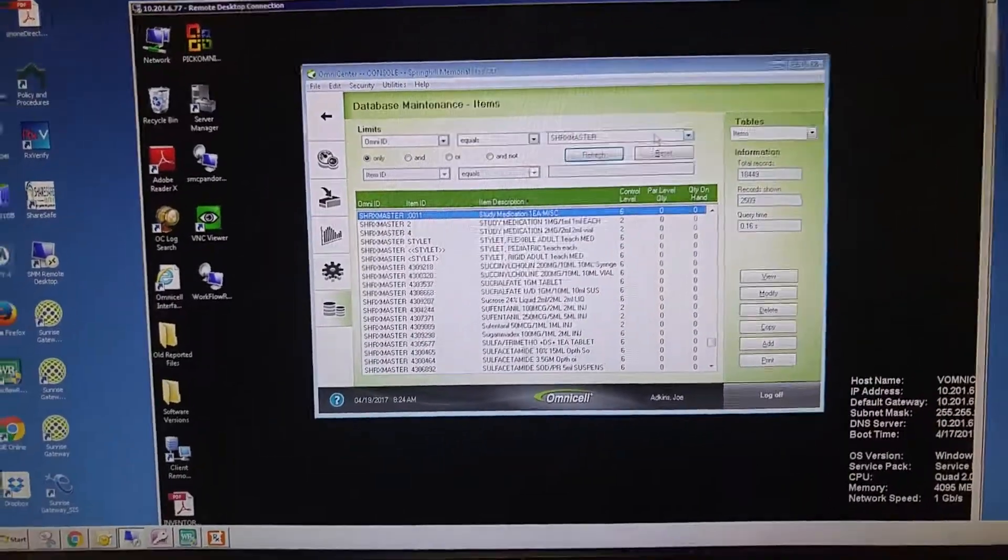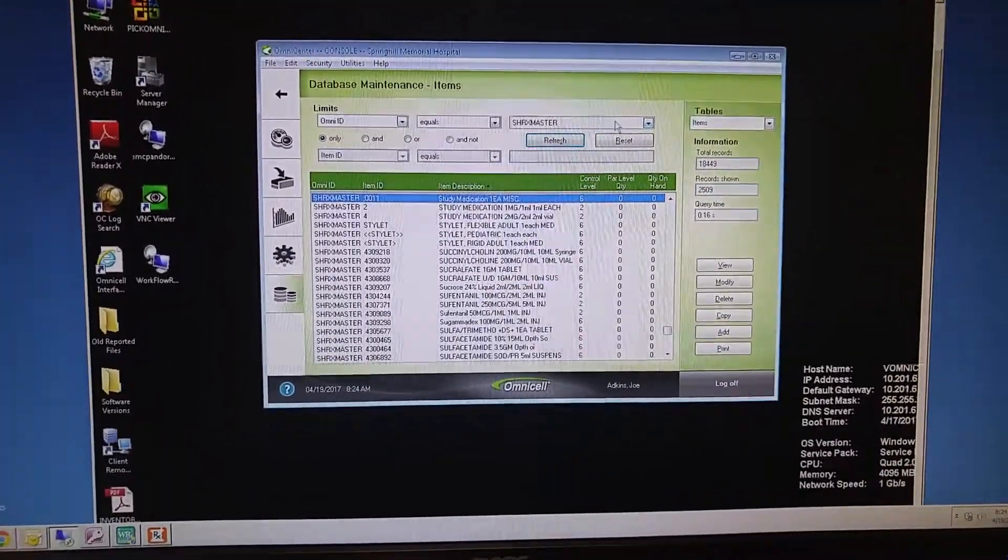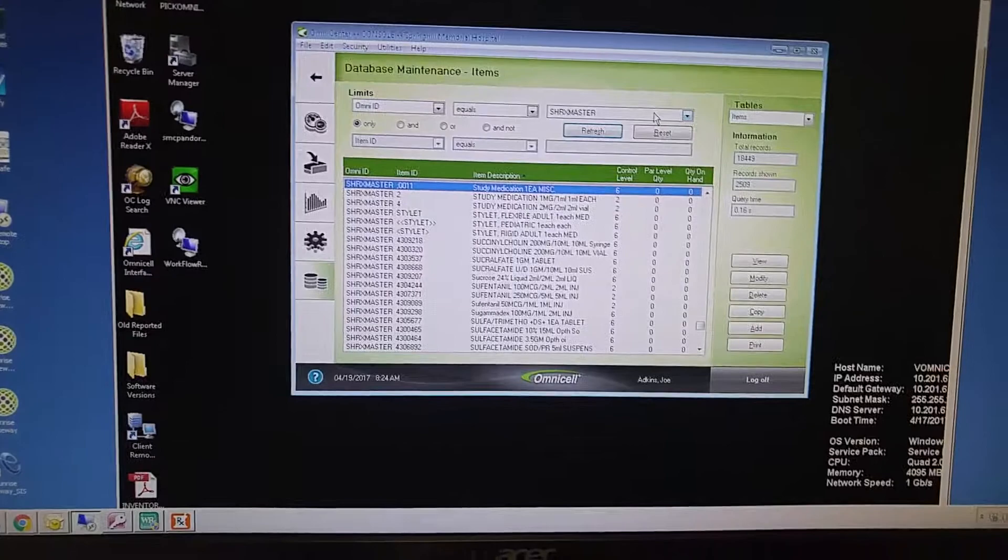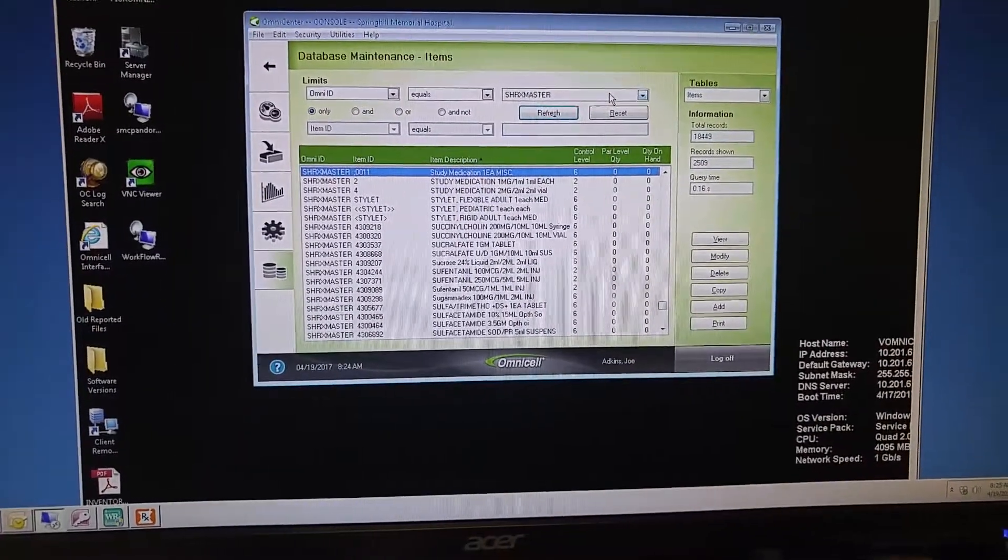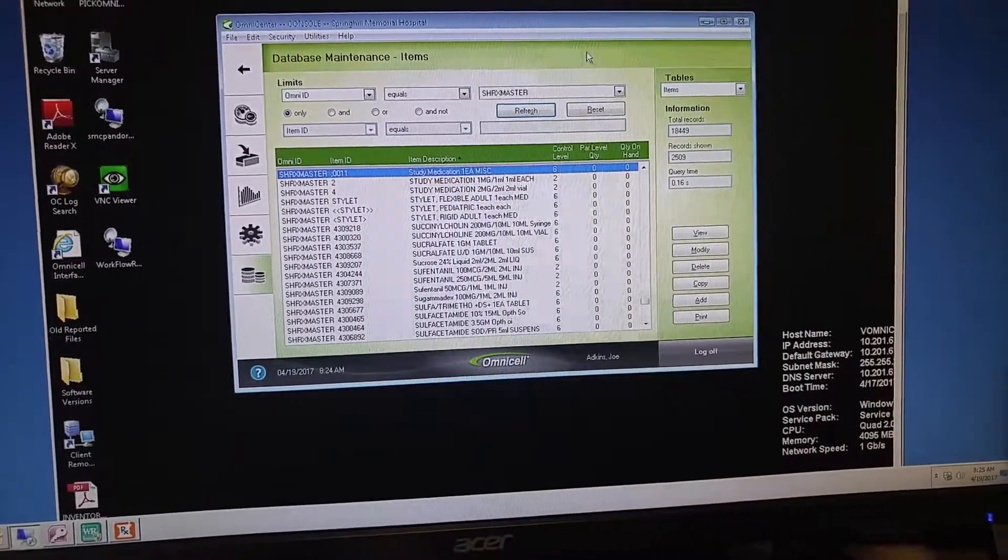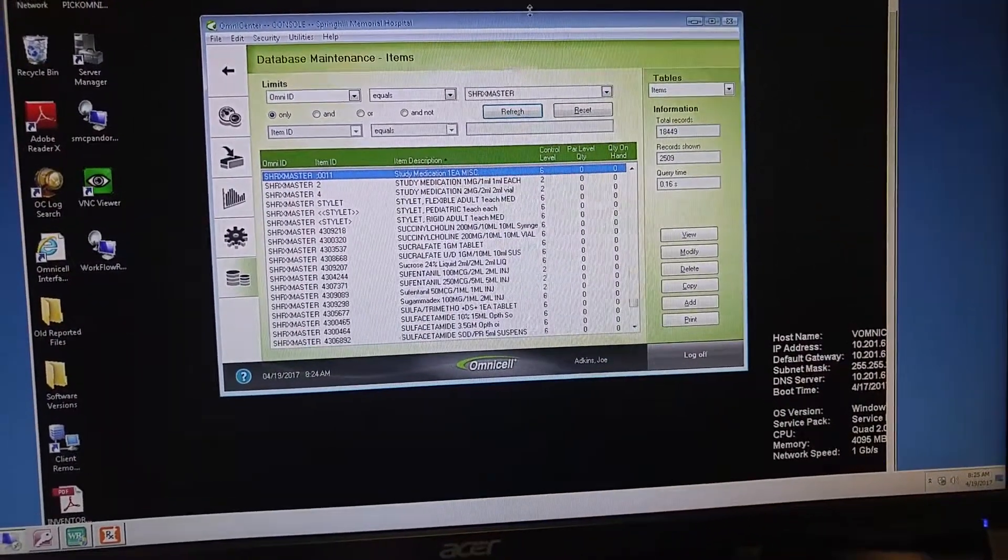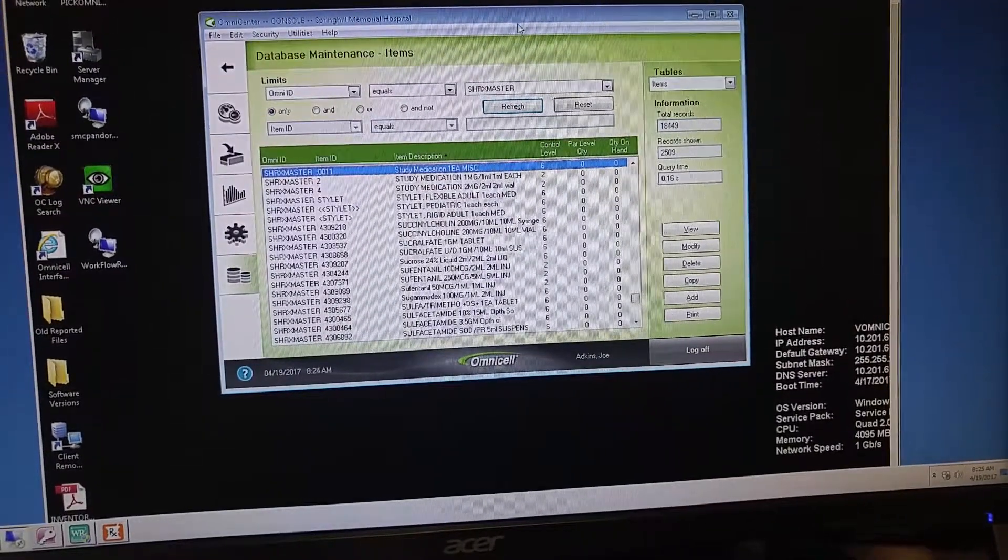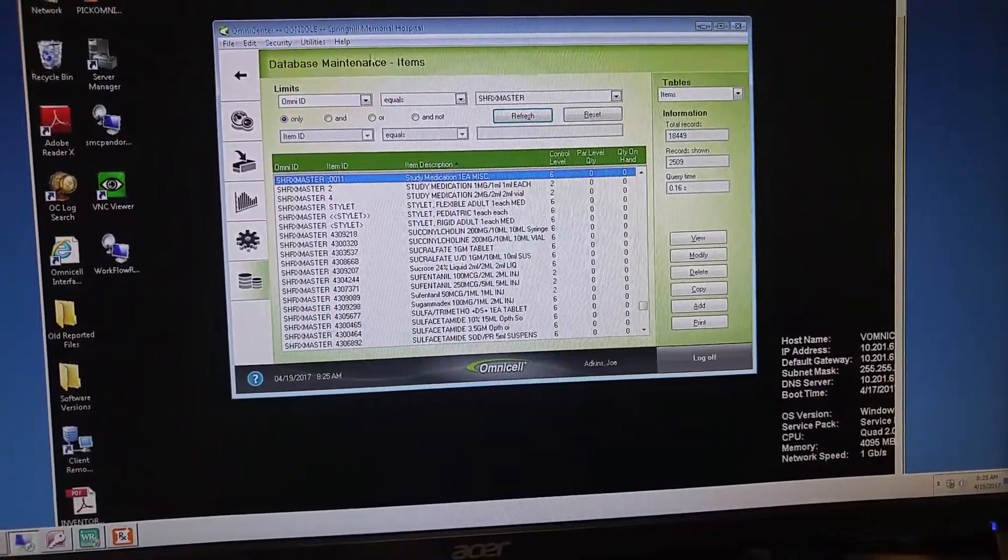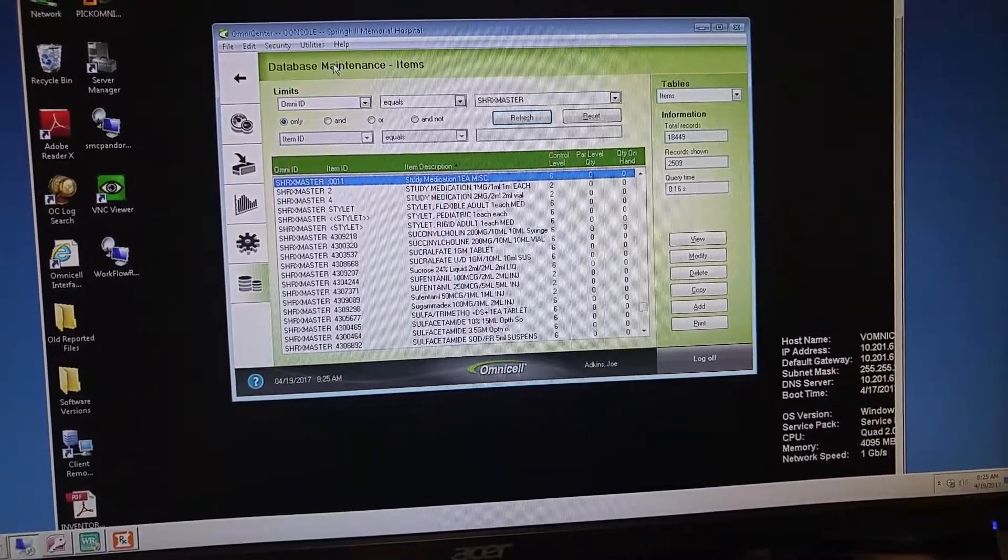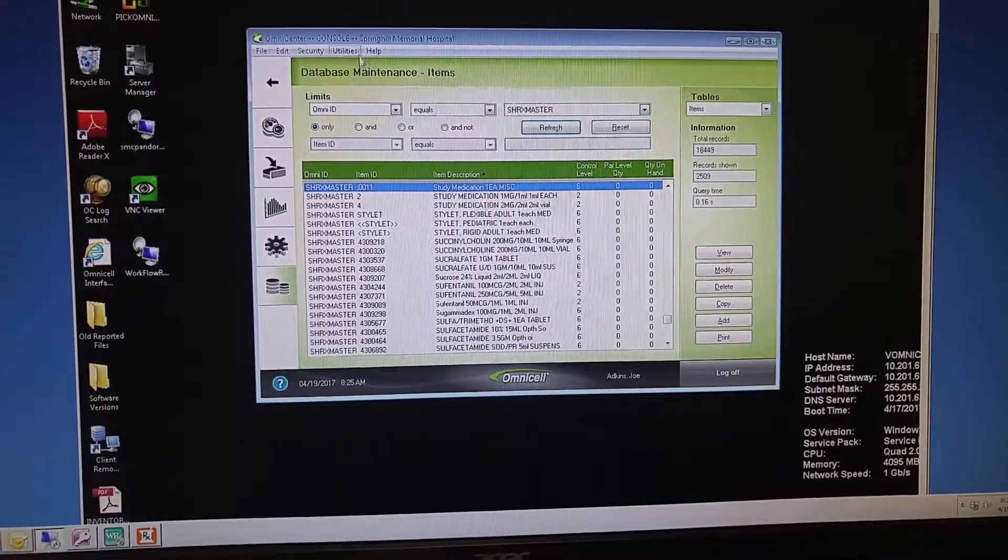Okay, this is how to load a new barcode into the OmniCell for an item that has not currently been loaded. First, log on to the OmniServer, and we want to double-check that this item is not barcoded correctly or not barcoded at all.